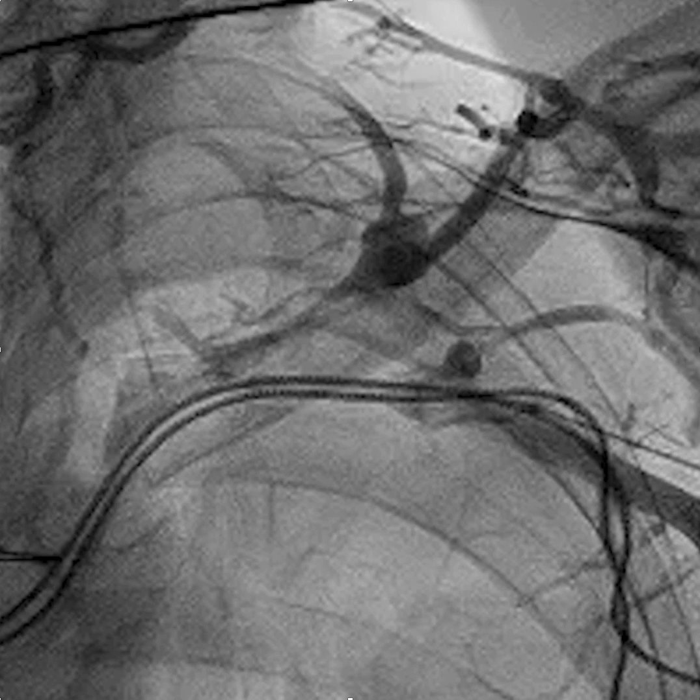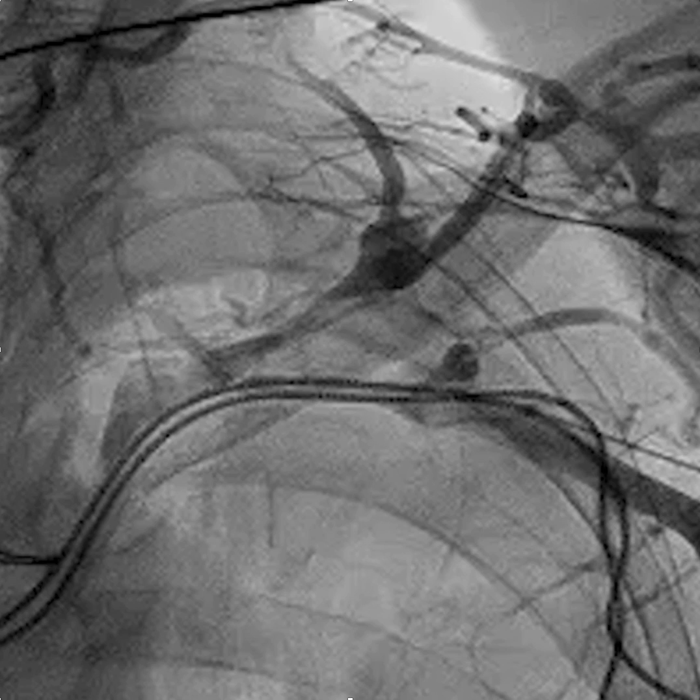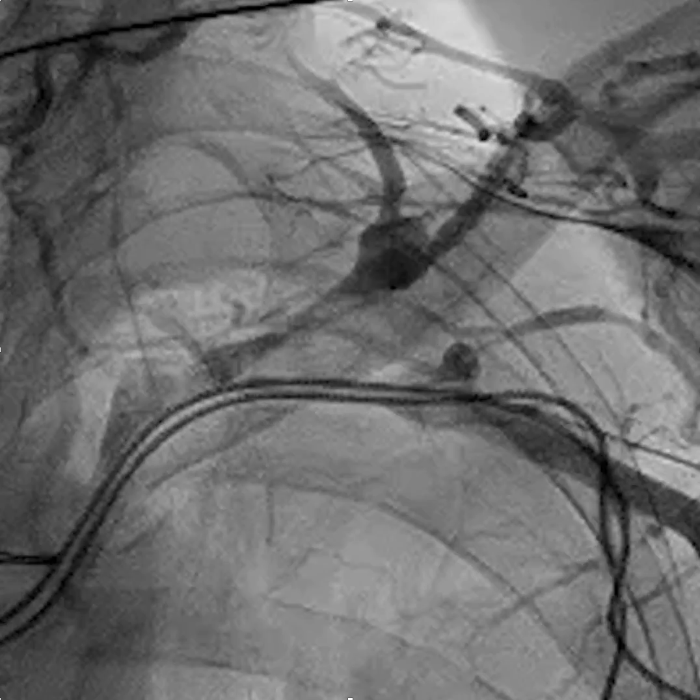This is a video on axillary vein access in a patient with existing leads and subclavian occlusion. You can see with the peripheral venogram that there's this area of occlusion with extensive collaterals. We're going to attempt to access the vein while the contrast is flowing, which plumps it up and makes it easier to enter.